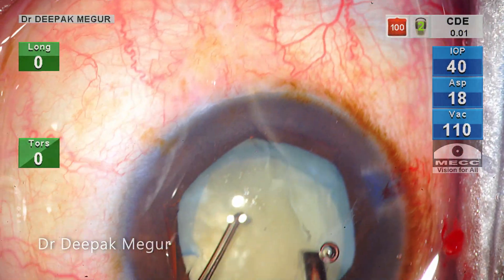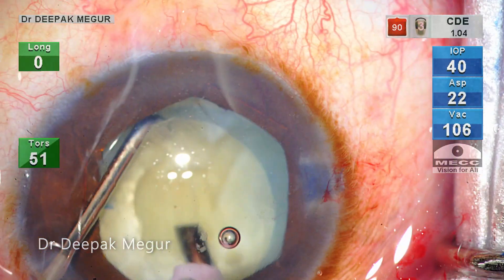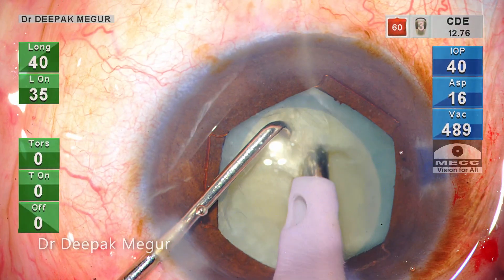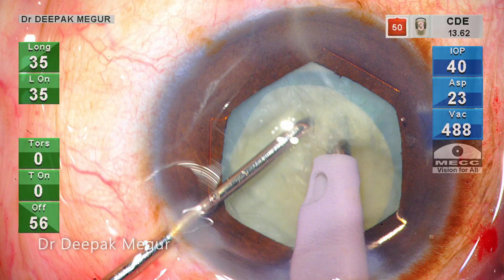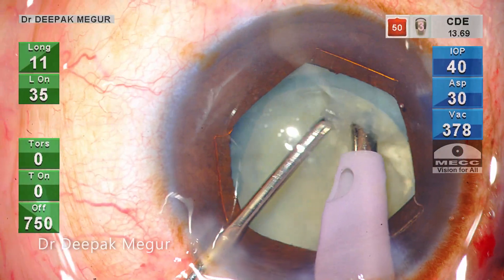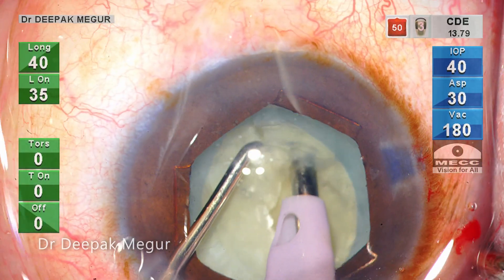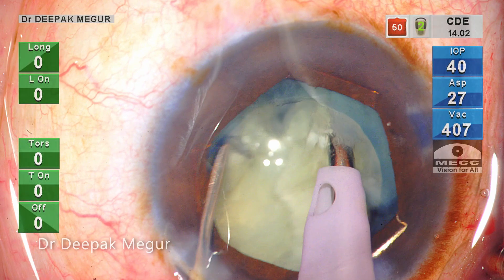I aspirate the superficial epinucleus and then do a couple of trenches so that I can bury my phaco tip deep into the substance of the nucleus, and I'm performing my first vertical chop here. The grip is not great and the nucleus slips and tilts. I re-grasp and chop it once again.